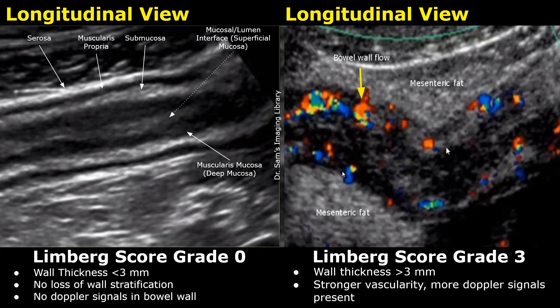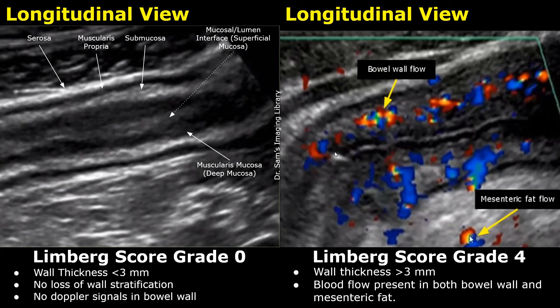Grade 4 is the most severe form. You will find increased vascularity in the bowel wall and increased vascularity in the surrounding hyperechoic mesenteric fat. Color Doppler signals are seen not only in the bowel wall, but also in the mesenteric fat.